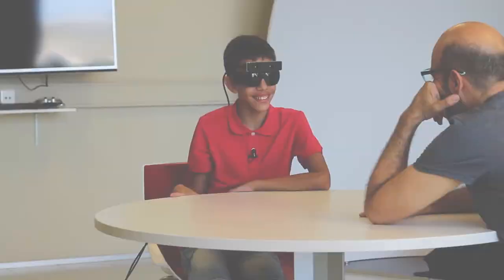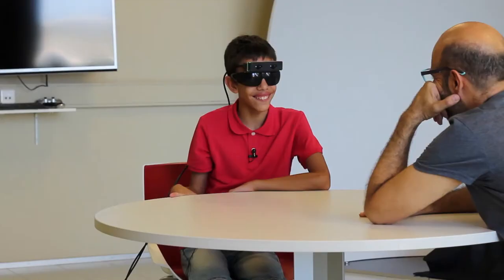The glass idea is extraordinary. The invention is cool. I'm so interested in this idea. With this thing, I dare to hit the streets of my area.